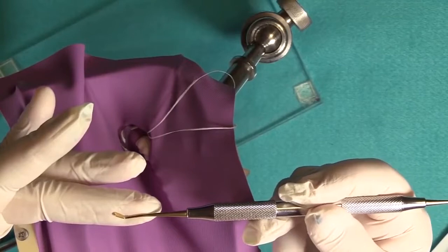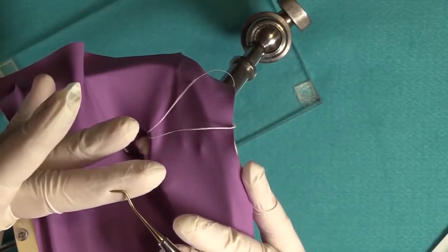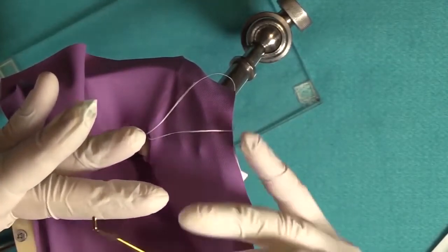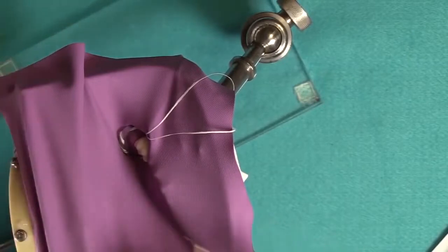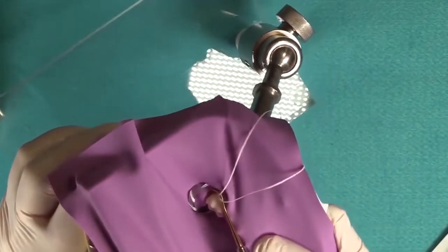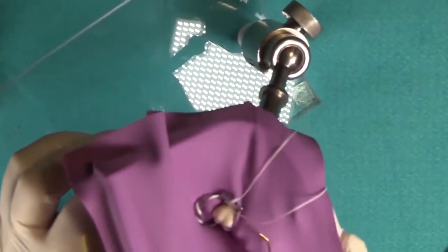It's like a golf club, actually. I use this end because what I'm doing, I'm going to lay the instrument on its side and push the dam off this way. Because you don't want to do this with your instrument because you're going to poke a hole in it. Sure. So by using the side of the instrument, and don't forget your finger rest, folks, you just slide and just take an edge and slide it off just like that.